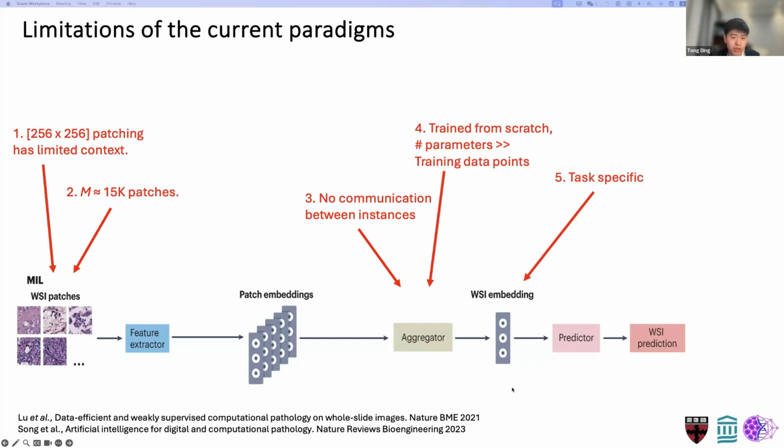As a result, the trained slide-level embedding is task specific, and such a training method is typically unimodal only and does not utilize complementary text or genomics information.